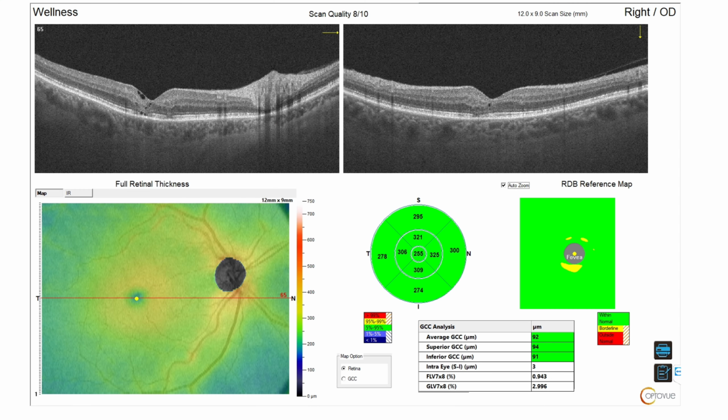So, anyway, we get OCT, and the OCT did give us some excellent information, but the OCTA really drove the point home. What we ended up finding on the OCT was something called an ILM drape. And an ILM drape is really a word that's pathognomonic for macular telangiectasia. I could walk through what happens in MacTel, but really it begins in the sensory retina. The abnormalities form cavitations in the sensory retina. Later, it affects the outer retina. And if the cystic cavitations fuse, you can actually get what looks like a macular hole formation.